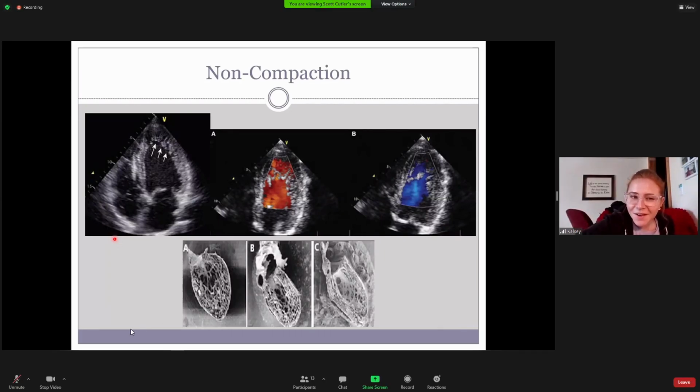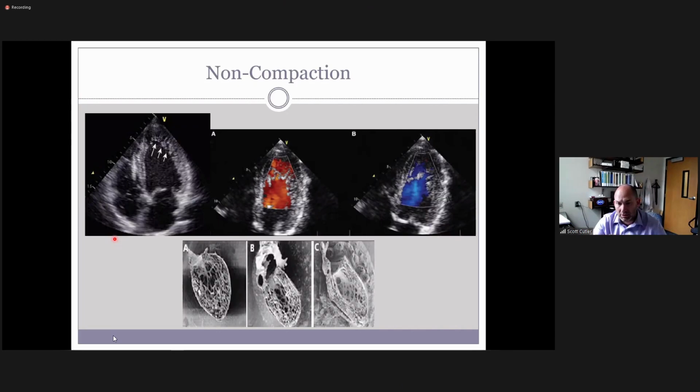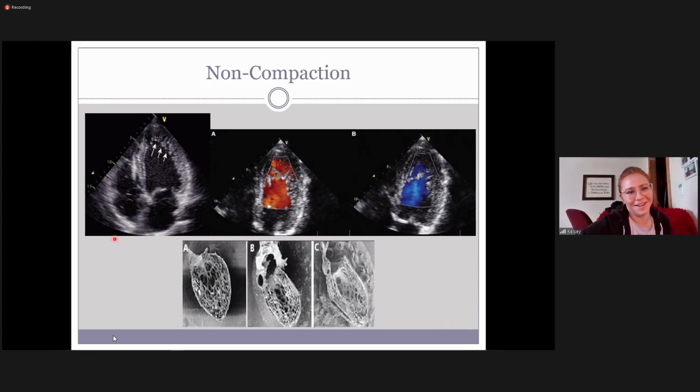Was it color maps or focus? Okay, I would not change the maps, but yes, you want to use your color. We definitely want to move our focus to the apex. Okay. I don't remember.